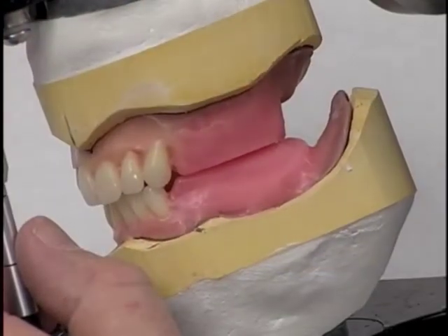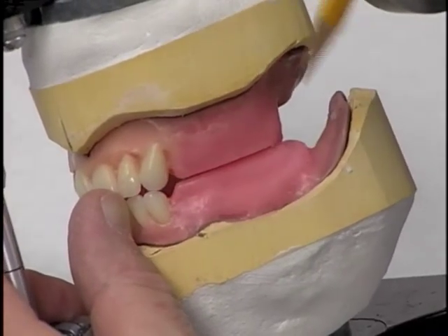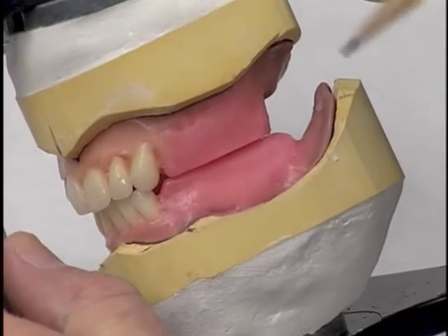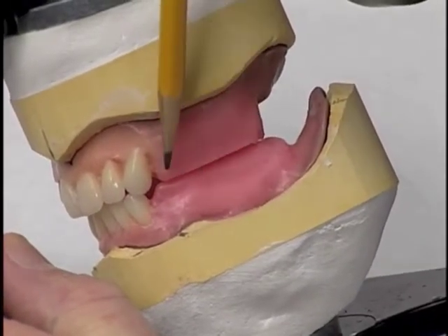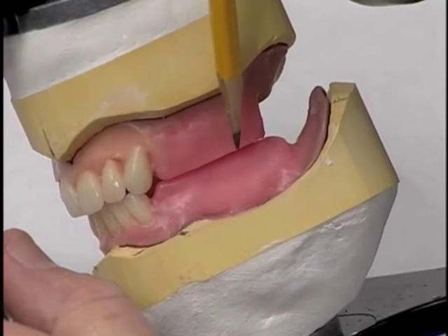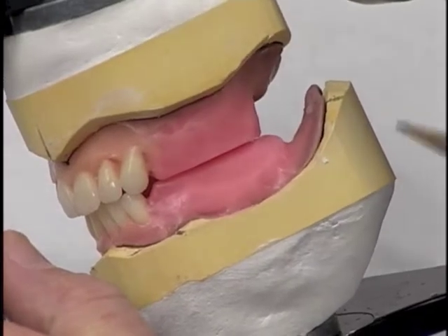The next thing we wish to consider is the height of the occlusal plane. Now, the occlusal plane is going to start with the tip of the mandibular canine, and it's going to end up, if we have it properly arranged, about 2/3 of the way up the retromolar pad. And as we can see, the occlusal plane on the wax rims is pretty good in that it starts with the canine and comes all the way back as just a straight line, and it should end up about 2/3 of the way up the retromolar pad, and that seems to be where we are.